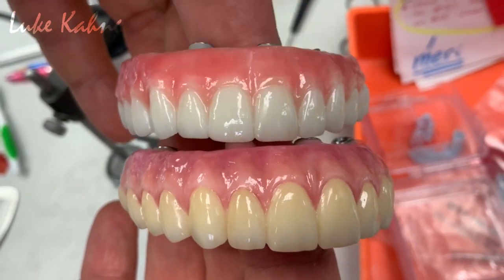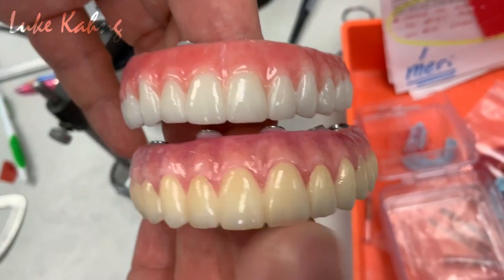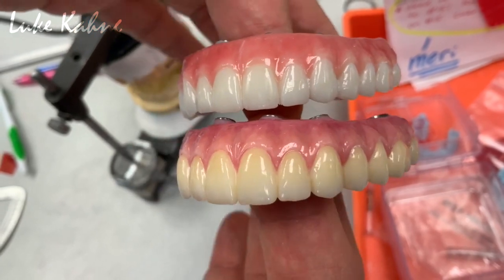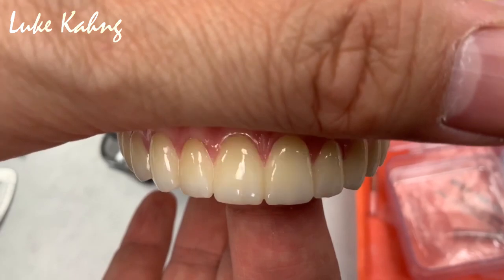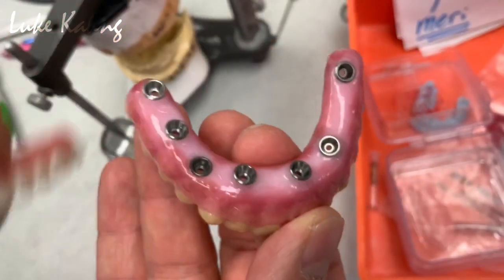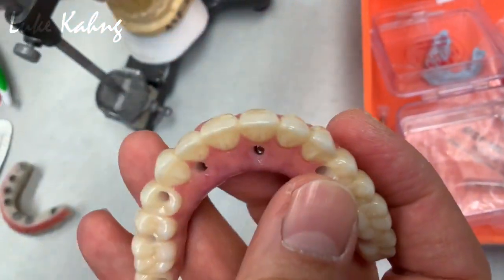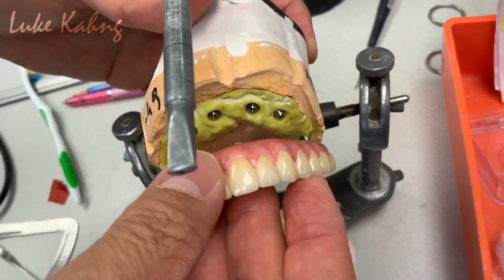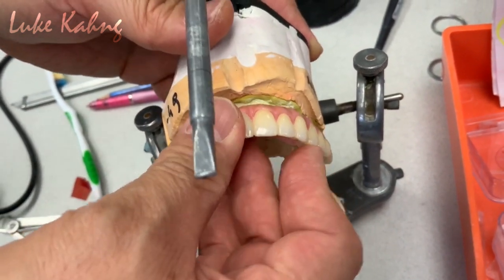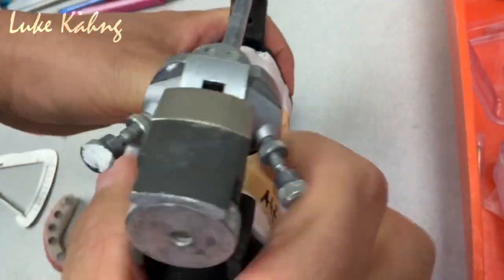Alright, this is a prototype, which is reprinted. And then after that, we've made an A2 base with real life like restorations. Okay. This is a 7 implant. Okay. Doctor gave us this nice tissue model. This cement correctly. And this is the finals. Yep.